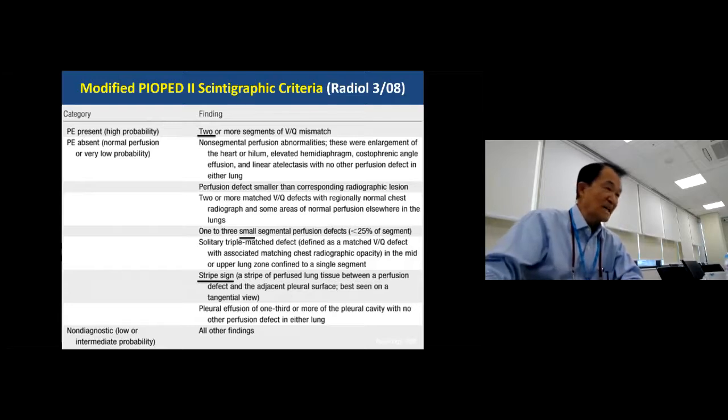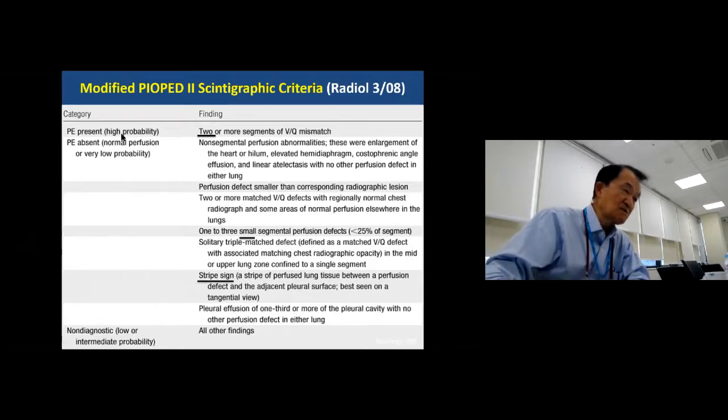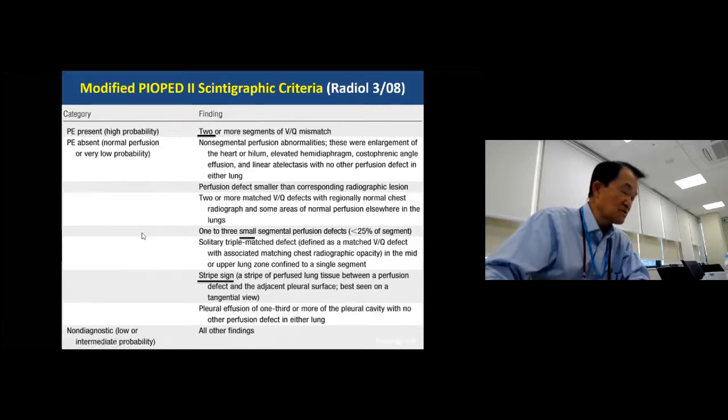When you say high probability, how high? The clinician doesn't understand. So always put down greater than 80%. Very low means less than 1%. You put a number here. I never use intermediate or indeterminate. That's useless terminology, useless. Most scans, most means 70, 80%, in that category. So the nuclear lung scan has been useless because of that report.